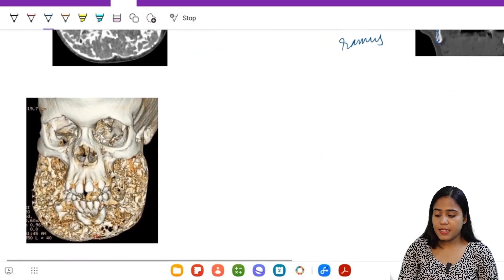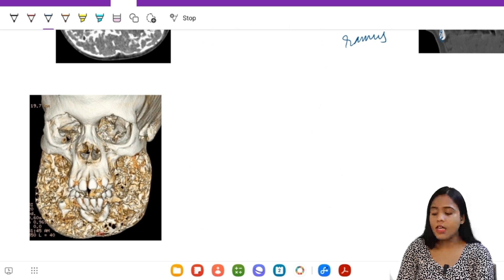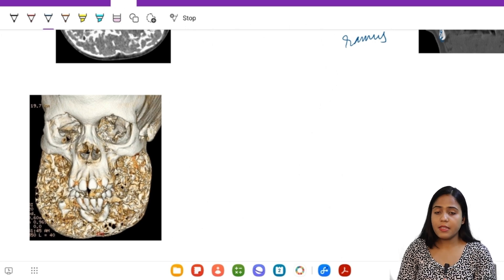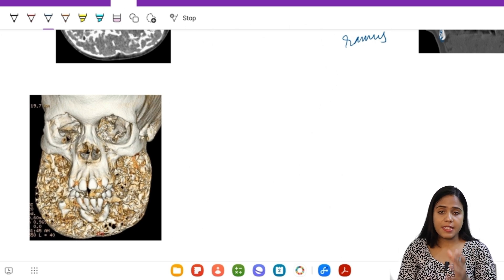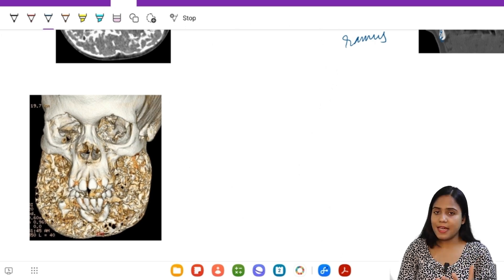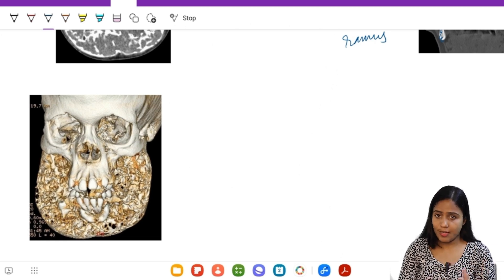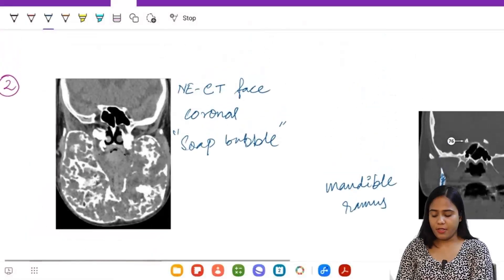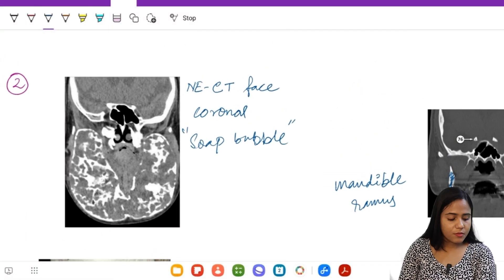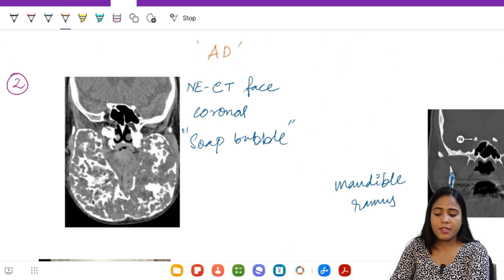Looking at the CT picture, you can better appreciate that in the region of the mandible, the mandible is no longer being seen. Instead, we see a big expansile bone lesion which is multiloculated and cystic - this is the soap bubble appearance. So what is the diagnosis?